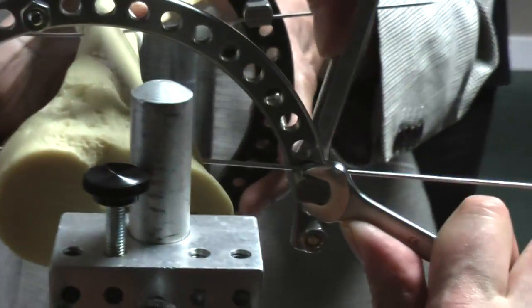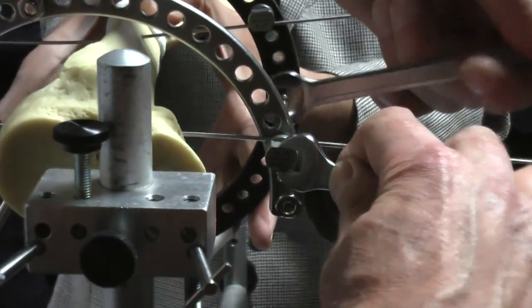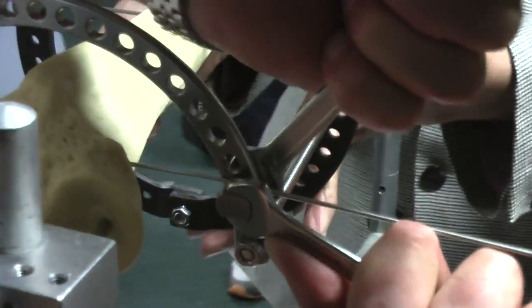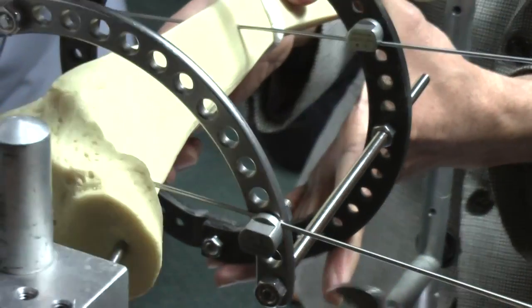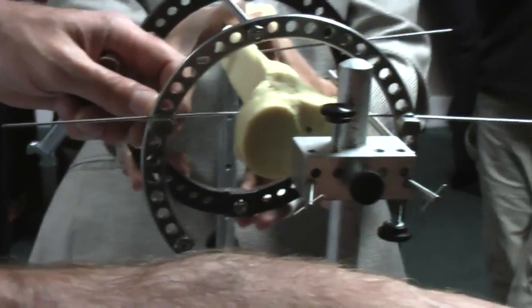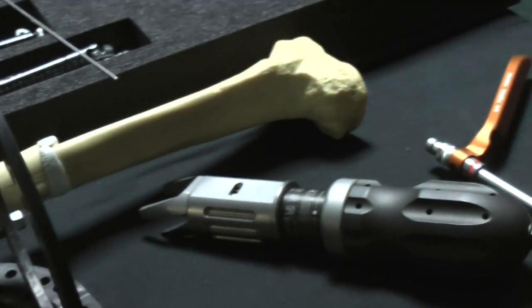Just nip these wires in a little. It's a quick question. It's not much to do with anything else. Does everybody use the tensioner for tensioning wires? All right, let's try another question. Does anybody not use the tensioner for tensioning wires, with the exception of Mr. Dennison?